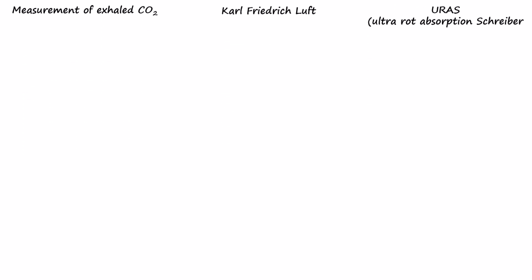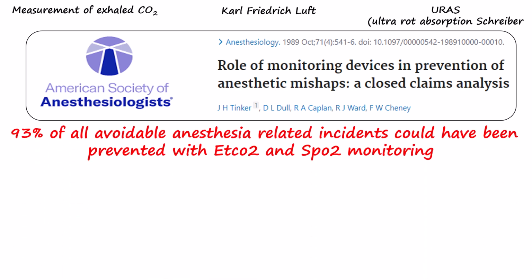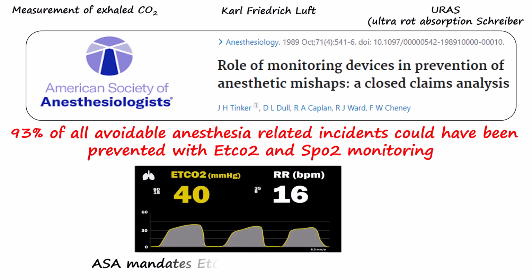Capnography is a very important part of modern anesthesia care. According to a closed claim analysis by the American Society of Anesthesiologists, 93% of all avoidable anesthesia-related incidents could have been prevented with the use of capnography in conjunction with pulse oximetry. Because of this, in 1998, the ASA made it mandatory to continuously monitor end-tidal CO2 in all patients receiving general anesthesia. Today, capnography is widely used not just in the operating room but in many areas of healthcare to improve patient safety.